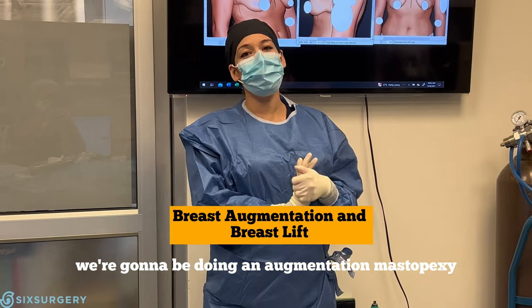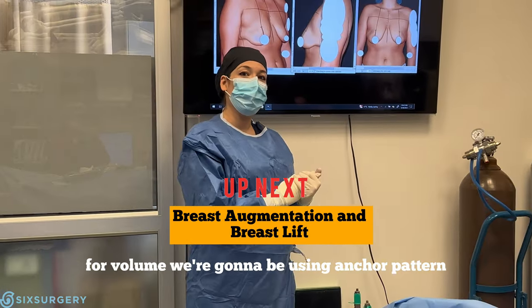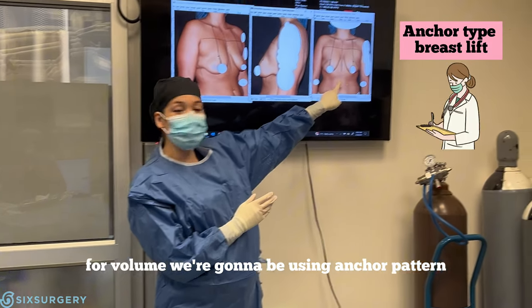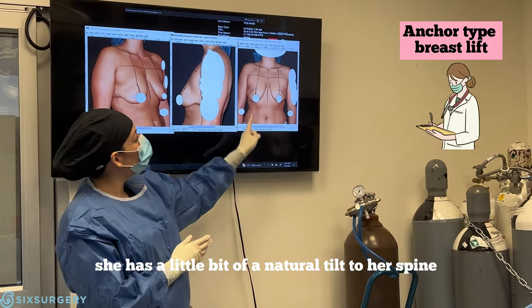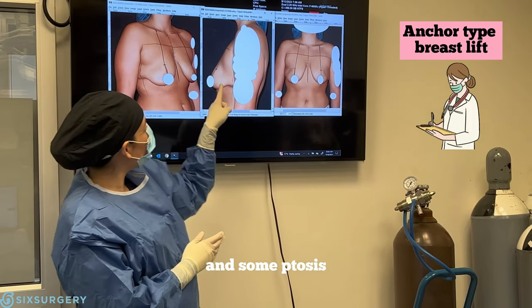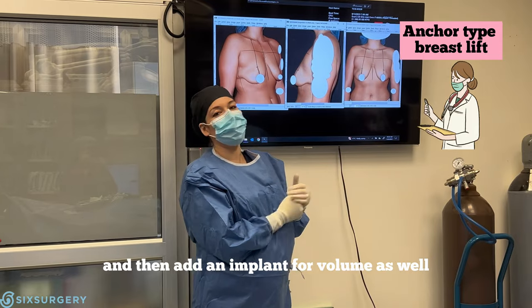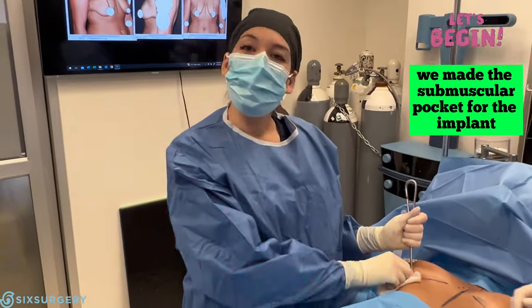For our next case we're going to be doing an augmentation mastopexy — that's a breast lift using an implant as well for volume. We're going to be using an anchor pattern. This patient has a little bit of a natural tilt to her spine and some ptosis, so we're going to lift the breast, make a perkier shape, and add an implant for volume.